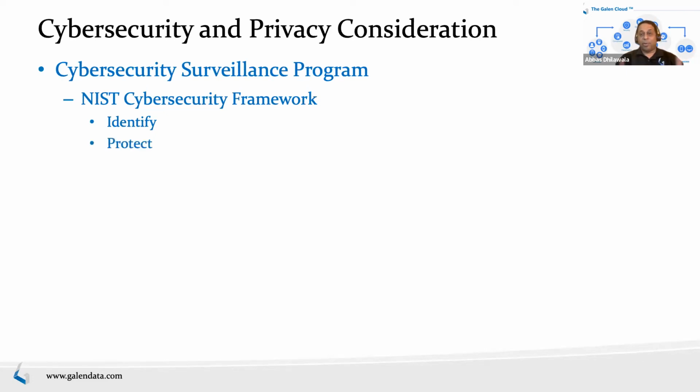And then second is protect, which is designing risk mitigations. As part of your design and development, you put in risk mitigations, and you also put risk mitigations during operations. If you have systems that are online, you may want to put simple things like firewalls and antivirus scanners, but also things like log surveillance and other kinds of protections that you can have. But then you also have to think about when events can happen.